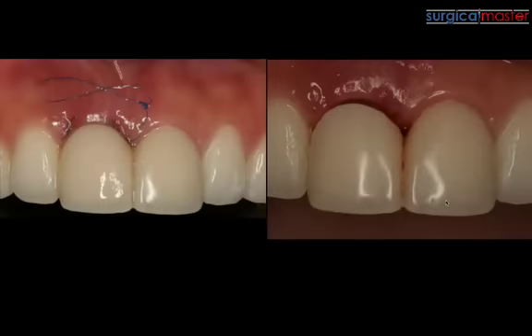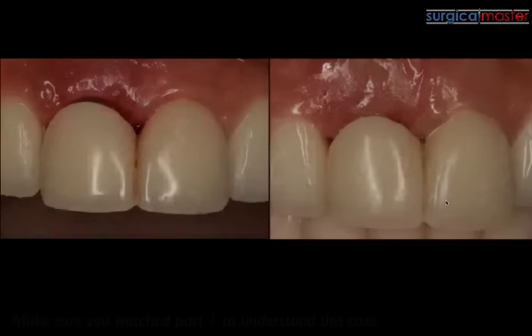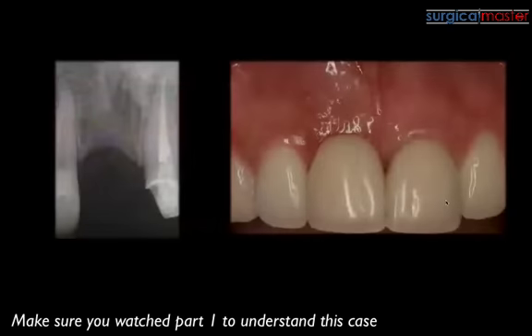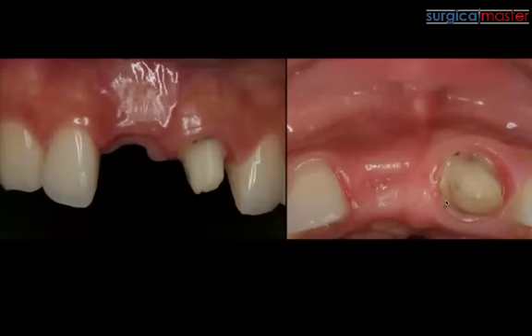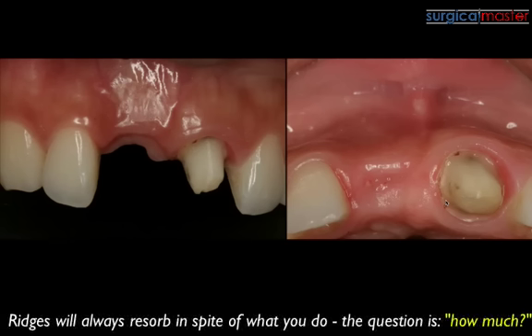Once the site is healed, you want to evaluate with a three-dimensional scan. So in 2D, it looks quite good, but remember, we'll have a natural resorption process. And in spite of my effort, and I want to make a very important point here, you can graft all you want, and you can put anything you want in there. Your ridges are in the process of resorption.